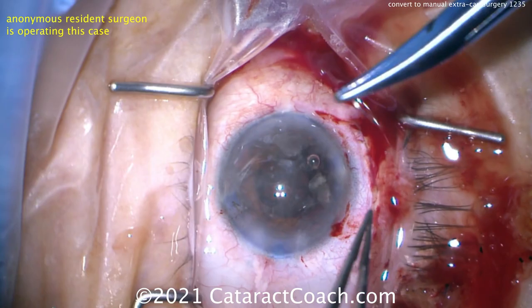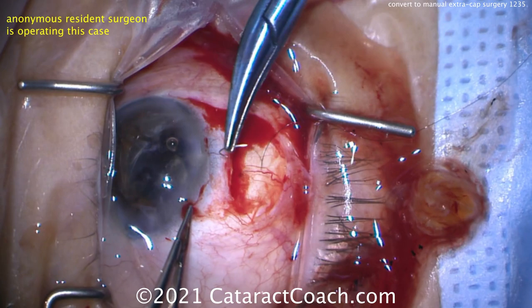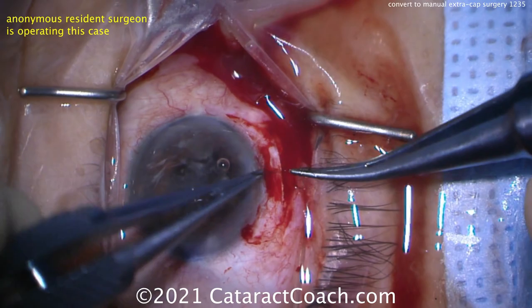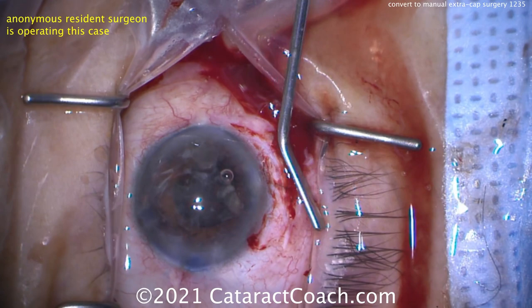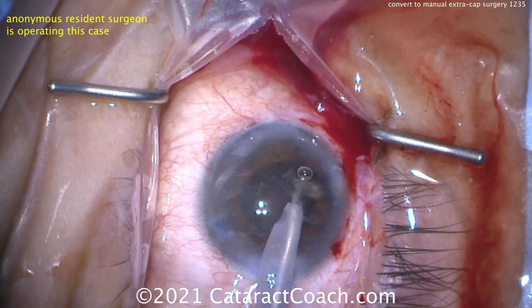Now you can go back and remove the remaining lens cortex. We'll examine the extent of the capsular bag — is there sufficient support? Where did the bag break? One nice suture going in here. Getting that nucleus material out of the way and tying up the suture. In this case, we're going to try to put in a sulcus lens — that'll be the best option. Cleaning up cortex is our next step. Now using a bimanual approach, first the FACO probe to get some larger pieces out.